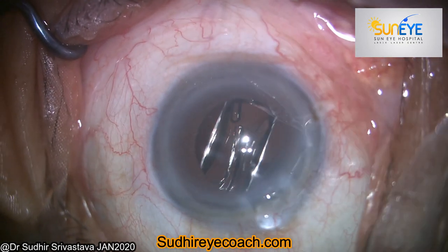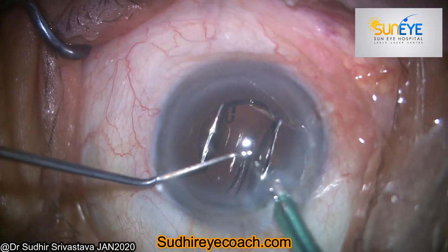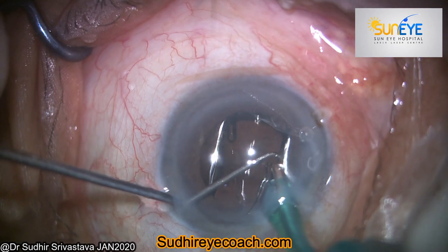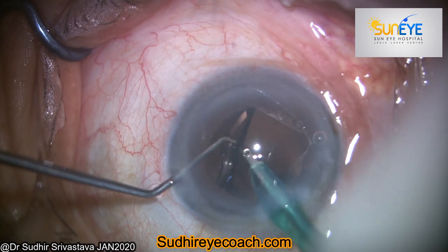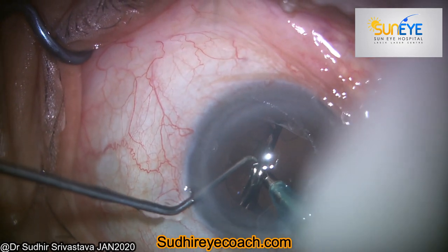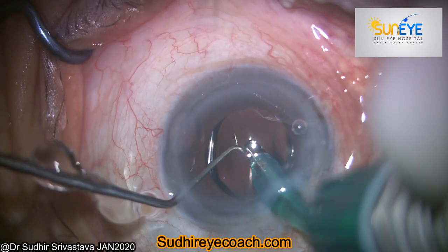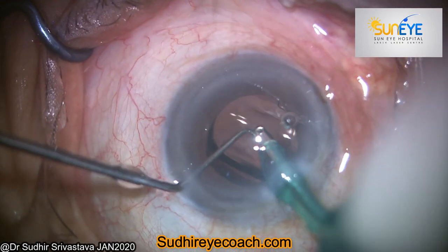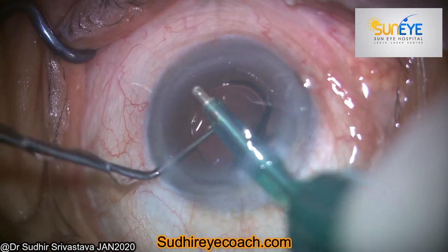As we all know, proper OVD removal is mandatory after IOL implantation. Any leftover OVD would create raised intraocular pressure and post-operative mild inflammatory reactions. There are two types of OVD: dispersive, which is sticky and coats the ocular structures and is used to protect the endothelium, and cohesive, which is thick and used to maintain the anterior chamber.